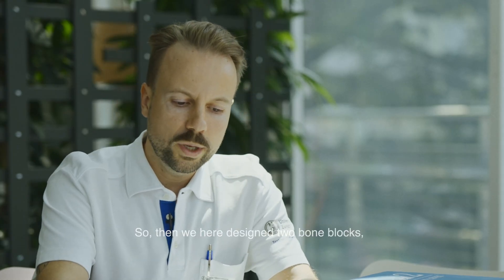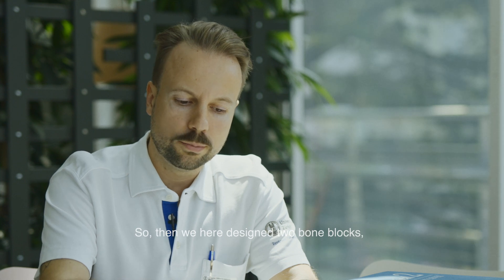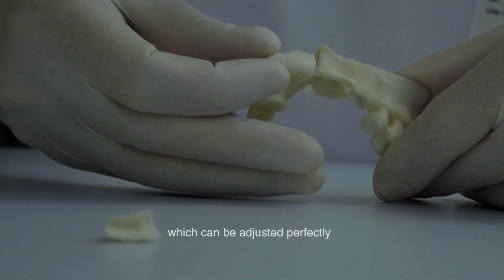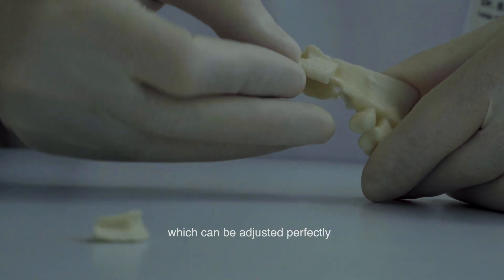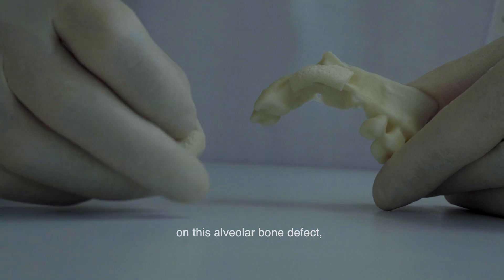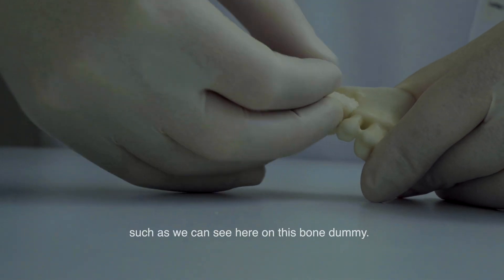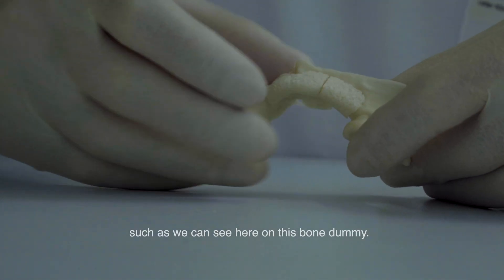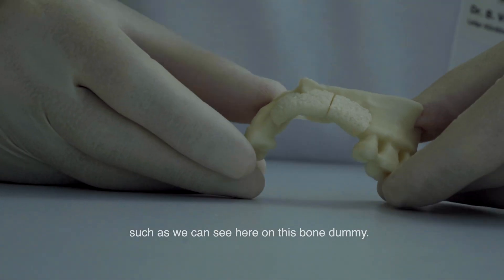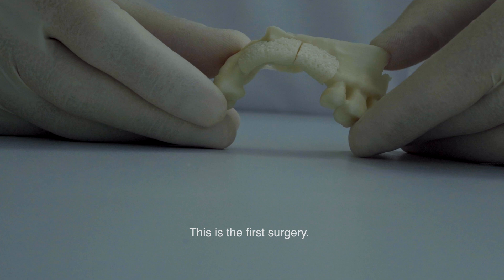We designed two bone blocks which can be adjusted perfectly on this alveolar bony defect, as shown here on the bone dummy. This is the first part of the surgery.